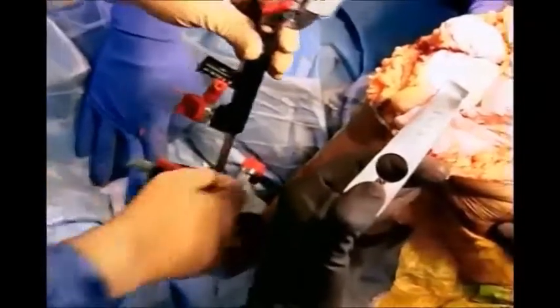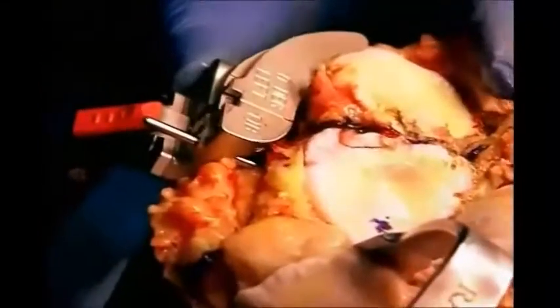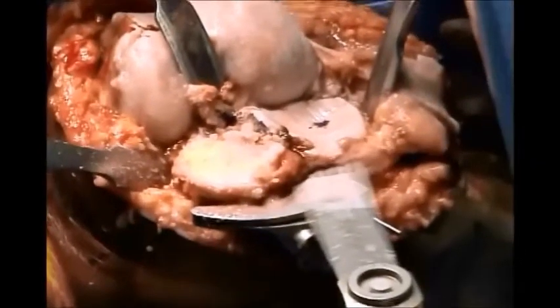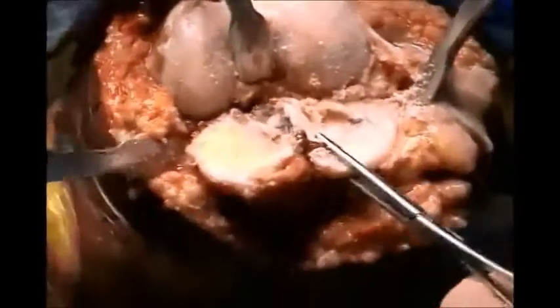Identify the plane of the posterior cruciate ligament at the lateral side of the middle spine — that is how you apply your tibial cutting guide. The tibial cutting guide is positioned in the middle of the ankle and slightly away from the tibia to give two to three degrees of posterior slope in the tibial cut.